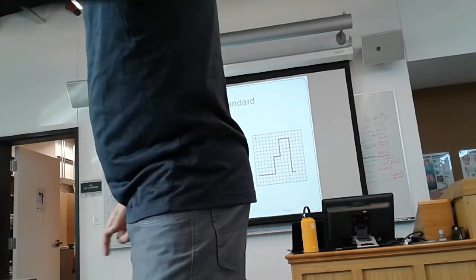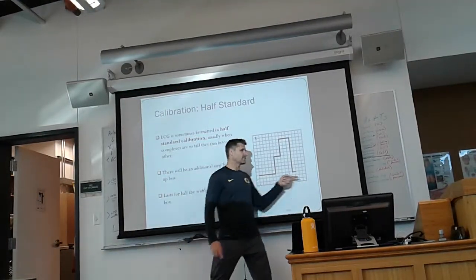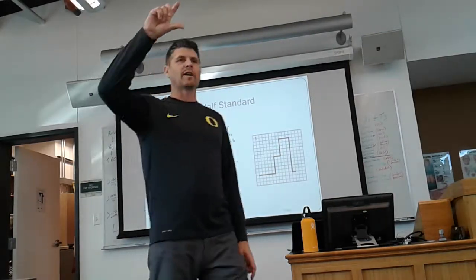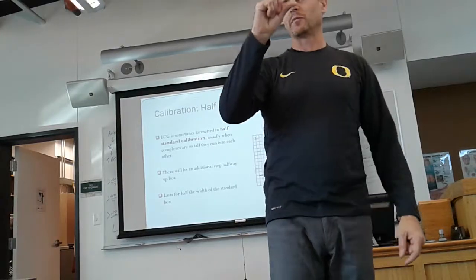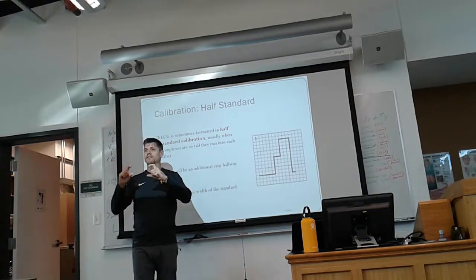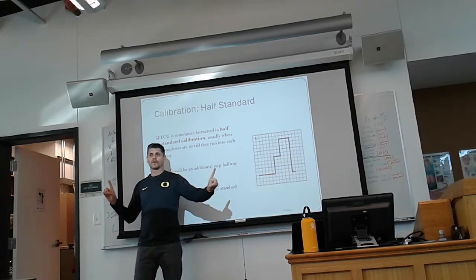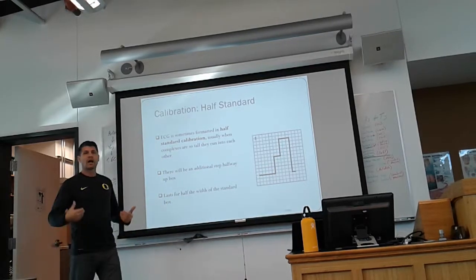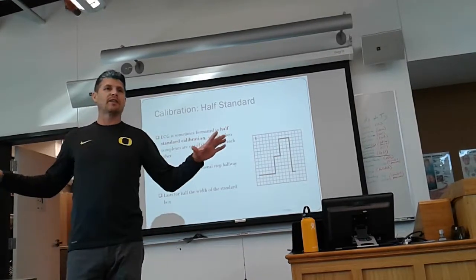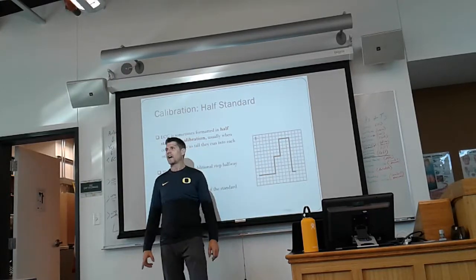And so we will pop in a half calibration standard, which keeps the timing left to right the same, but makes the QRS complexes half the height that they're supposed to be. Not just the QRS complexes. Everything electrically is half the size amplitude-wise as it's supposed to be, but time is still ticking away like it's supposed to. Does that make sense? So any of our measurements on rate would still be accurate in the same method that you're going to learn in just a few minutes, but the amplitudes will all be half the height that they're supposed to be.